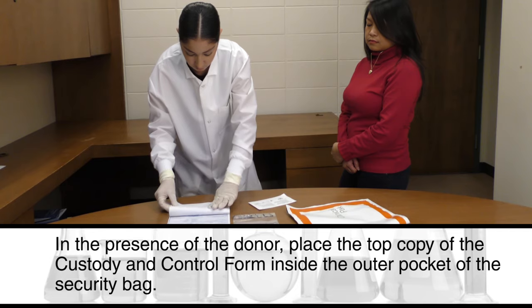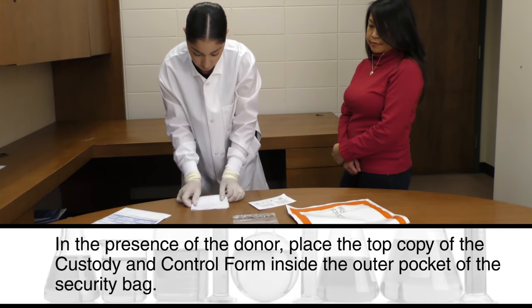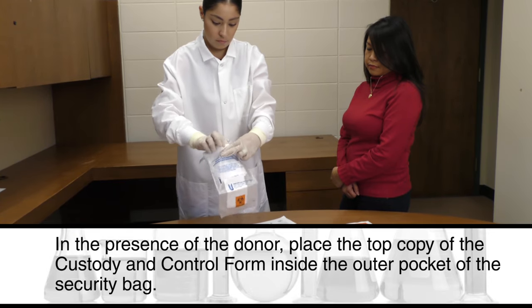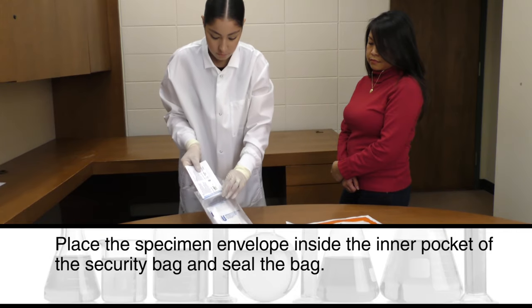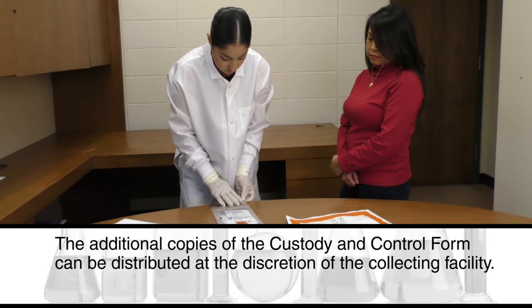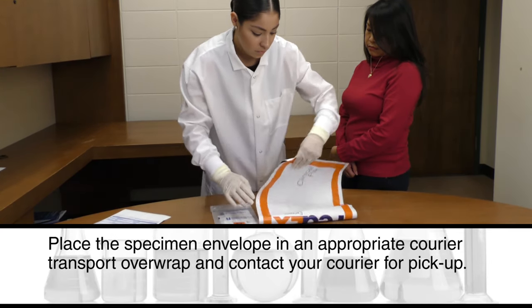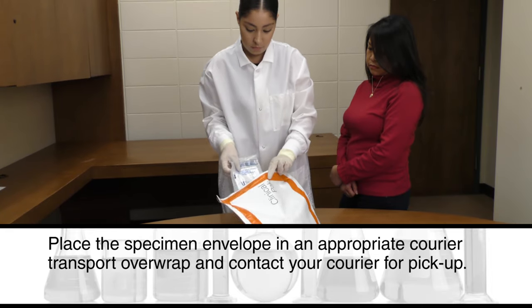In the presence of the donor, place the top copy of the custody and control form inside the outer pocket of the security bag. Place the specimen envelope inside the inner pocket of the security bag and seal the bag. The additional copies of the custody and control form can be distributed at the discretion of the collecting facility. Place the specimen envelope in an appropriate courier transport overwrap and contact your courier for pickup.